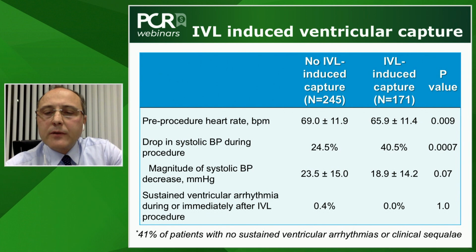Michael, let me further extend this discussion on possible issues, concerns or drawbacks of this current iteration of the device. Do you have any point, any comment to add here before taking additional questions from the colleagues? Yeah, I think one point is important to understand: the device, the catheter, the balloon, is not really a dilatation balloon. It's an application balloon. We just want to open it to 4 atmospheres, maximally 6 atmospheres. This is not a range we are usually working in in calcified lesions. So that is what we need to understand.